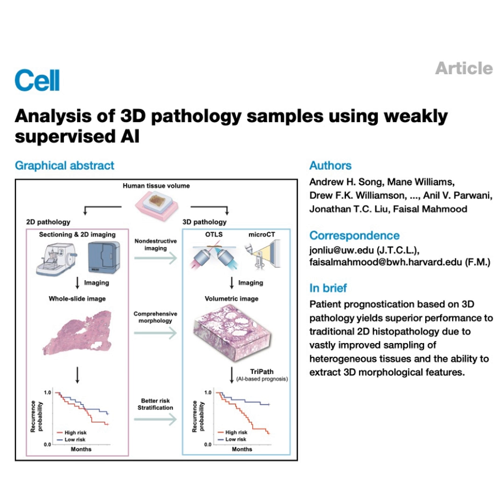So if 2D slices aren't enough, we need tech that captures the whole volume. That means moving beyond standard slides. What did the study use? Right. They used two main non-destructive 3D imaging methods. First up was something called open-top light sheet microscopy, OTLS. Okay. Think of it like super high-res 3D fluorescence imaging. They use special clearing techniques and fluorescent stains, sort of like a fluorescent version of the usual H&E stain pathologists use. And the resolution is amazing, 1 micrometer per voxel. That's way finer detail than the standard 5 micrometer thick slice you get clinically. Wow, okay. And the second one?